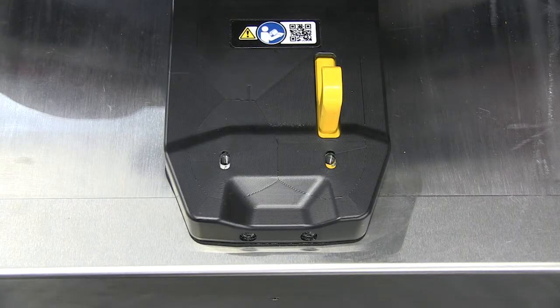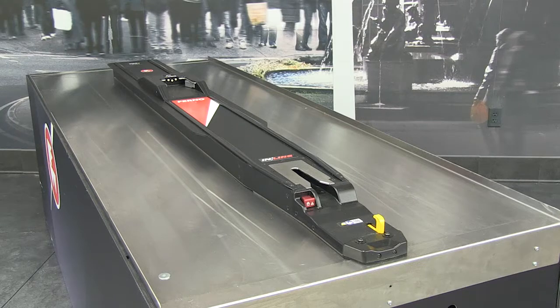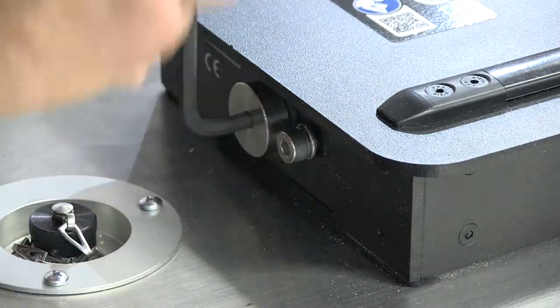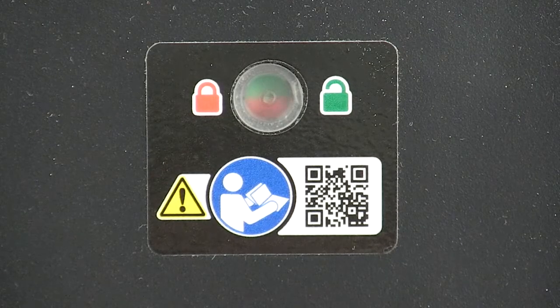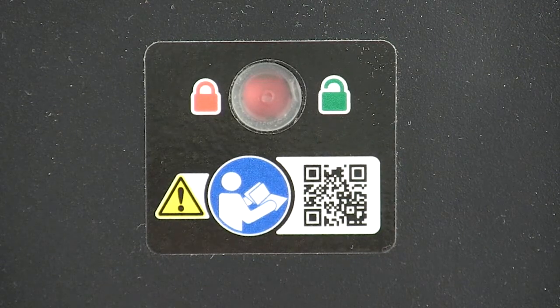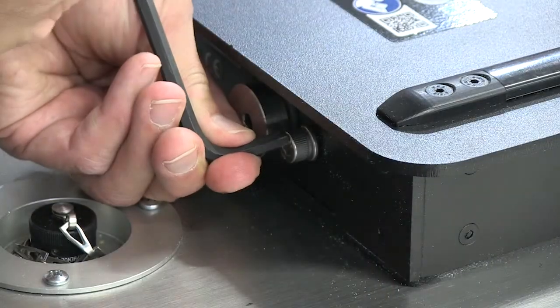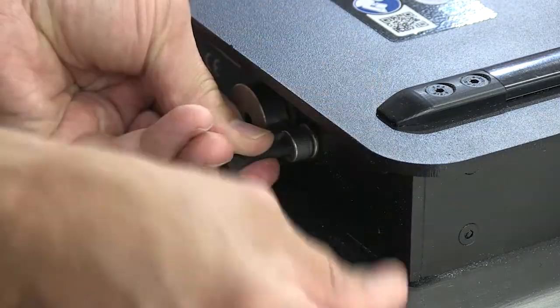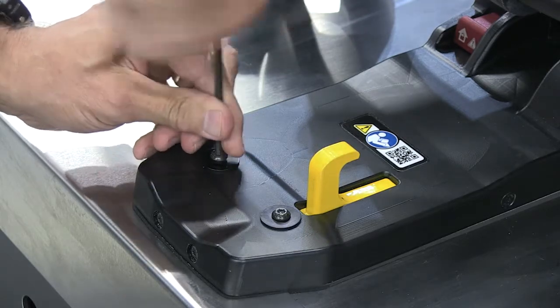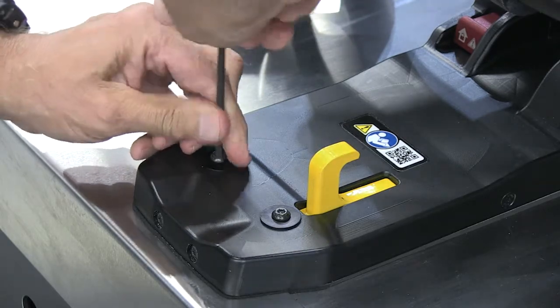Verify the upper fastening system is properly positioned on the mounting rail with the safety hook passing through the slot in the nose. The entire fastening system should be flat and level with the floor. Use a 6 mm Allen wrench to tighten the large fastening bolt. Verify the floor lock indicator window changes from green to fully red, which means locked. Use the same wrench to tighten the set screw until snug. Use a 4 mm Allen wrench to attach the nose screws and washers and tighten them until snug, but don't over tighten.